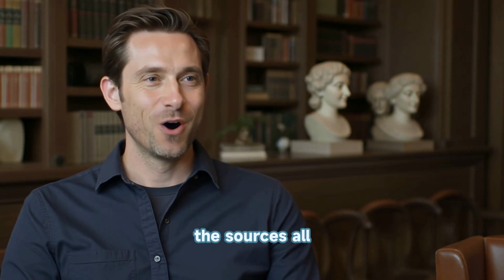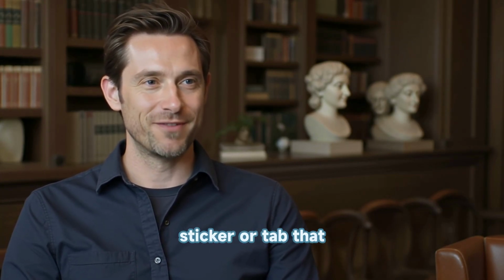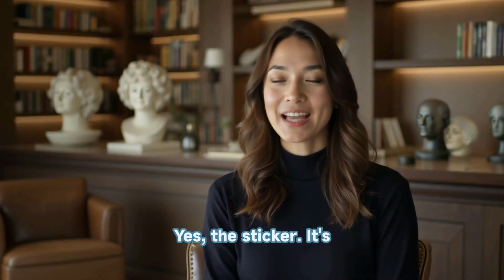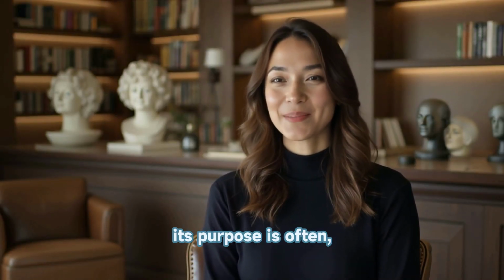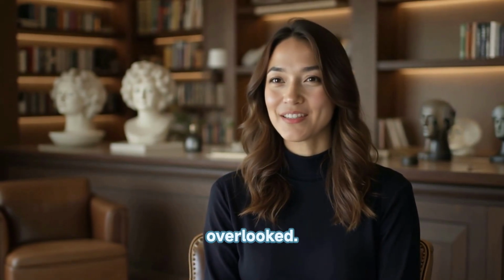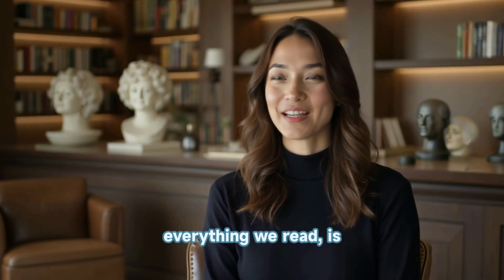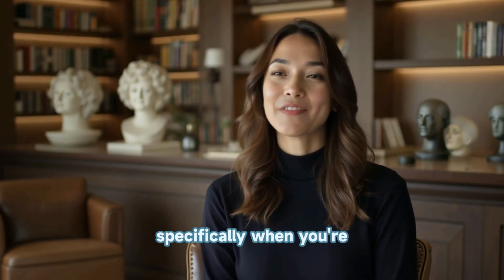Because the sources all mention this tiny accessory. Like a little sticker or tab that comes with the bag. Yes, the sticker. It's absolutely vital, but its purpose is often either misunderstood or just completely overlooked. So what is its purpose? Its main job, according to everything we read, is to cover the filter, specifically when you're doing things involving water.